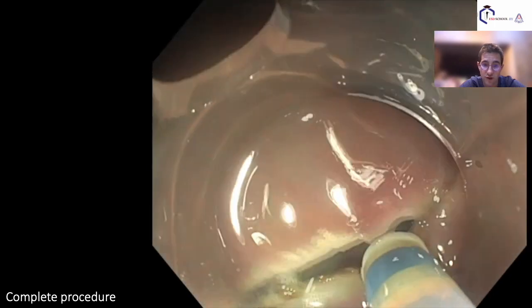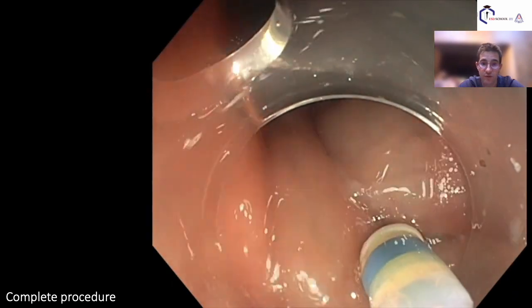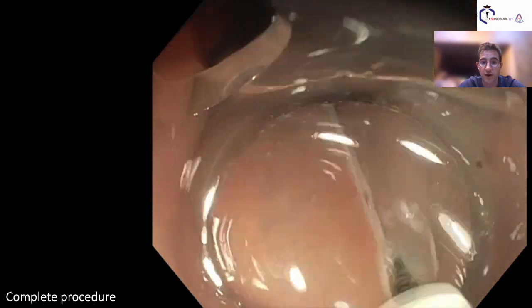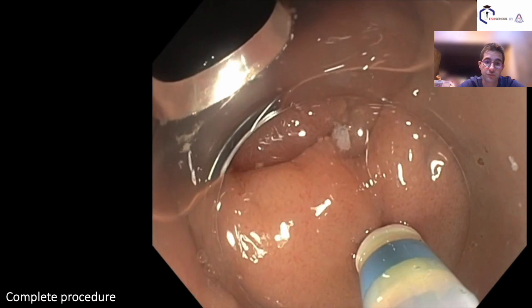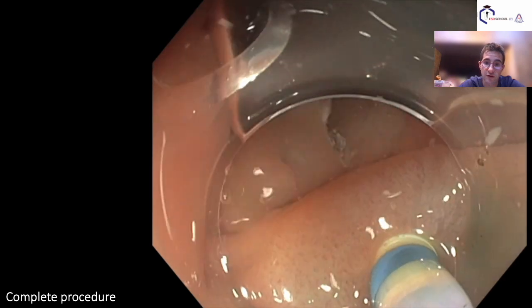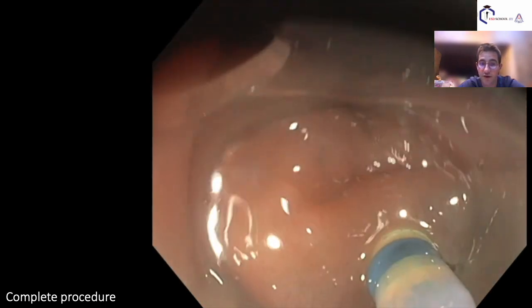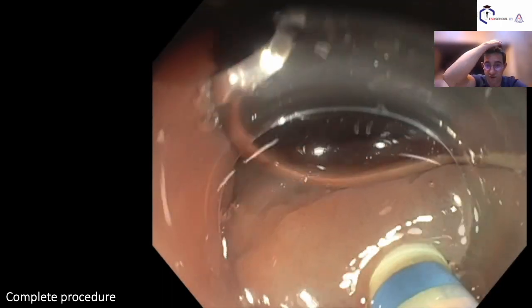It is always difficult to join an incision because at this point injection is less important, so sometimes you have to pass several times at this point where you should join your different incisions. I will inject with the knife directly because I'm in the rectum and it's easy to do it without risk because the submucosa is thick, the muscle is thick. Once again you have a valley here, you inject to create a heel.